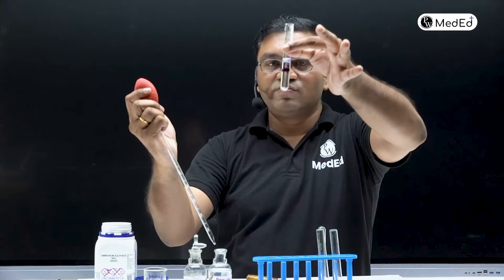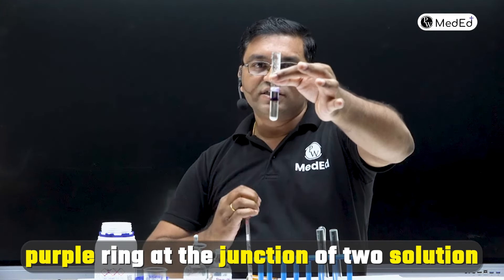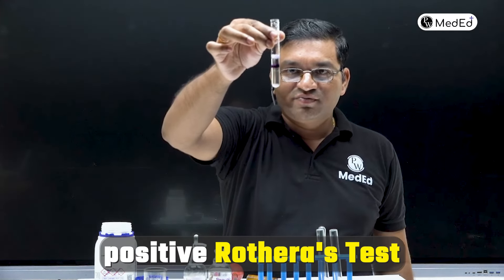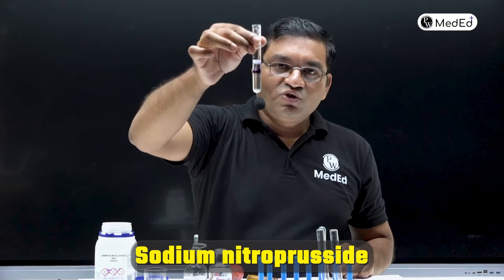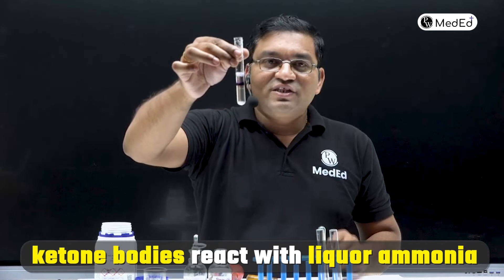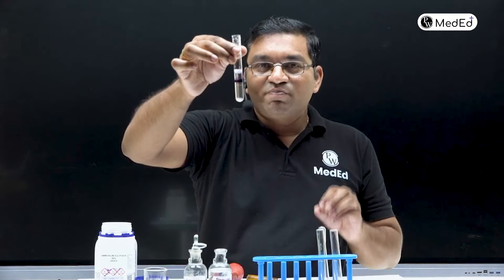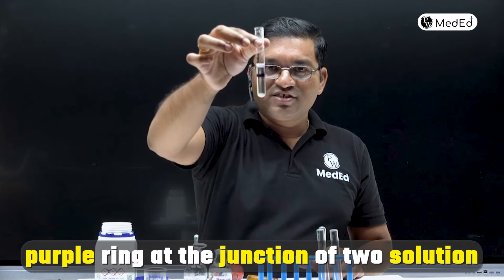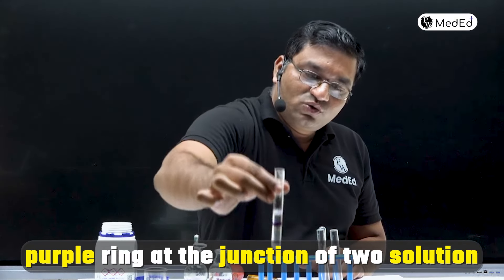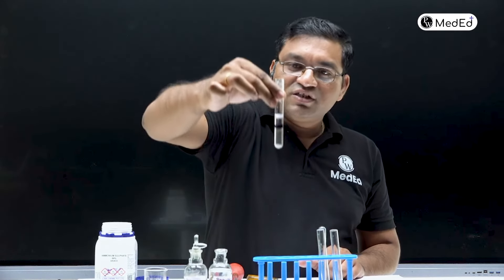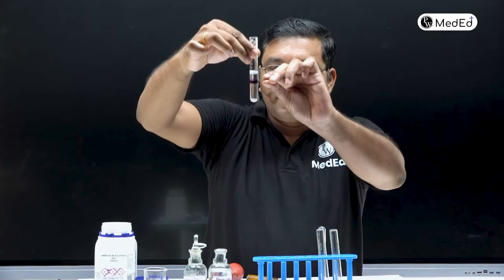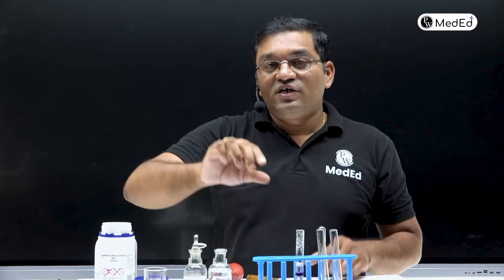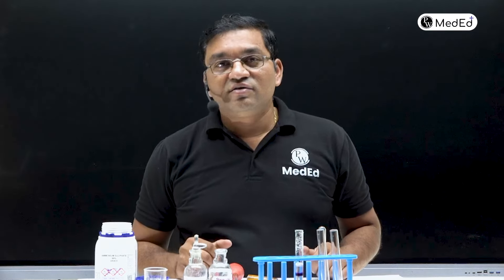The observation is a purple ring at the junction of the two solutions, which indicates a positive Rothera's test. In the presence of sodium nitroprusside, the ketone bodies react with the liquor ammonia and give the purple ring at the junction. If you keep the solution steady, you will get a thin, hair-thin ring.